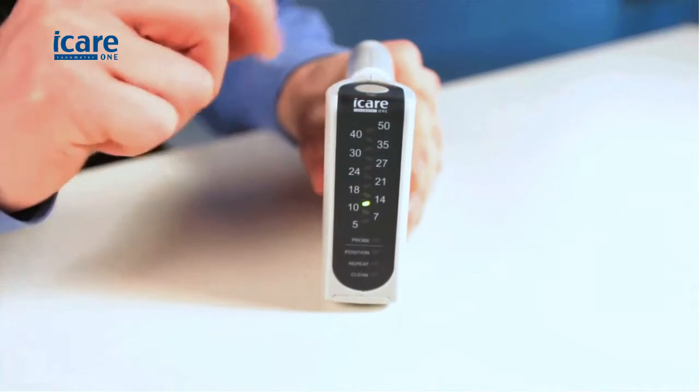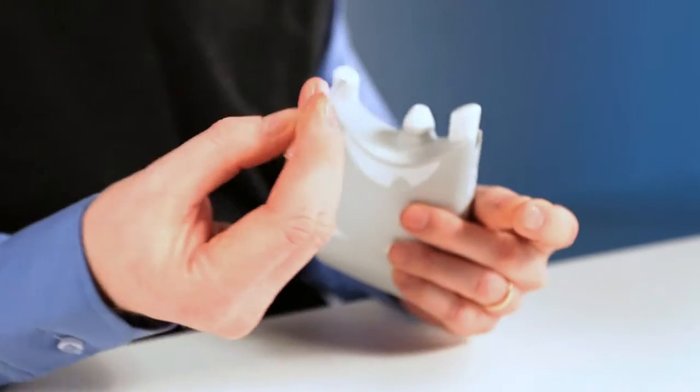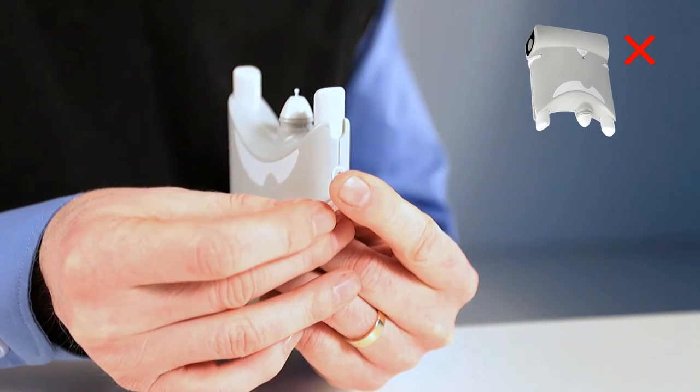Loading the probe: Press the measurement button to turn the tonometer on. Open the lid of the single-use probe and insert the probe into the probe base. After the probe has been inserted, be careful not to point the tonometer downward to prevent the probe from falling out.